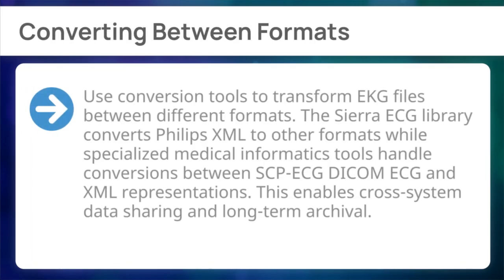Finally, converting between formats. Use conversion tools to transform EKG files between different formats. The Sierra ECG library converts Philips XML to other formats, while specialized medical informatics tools handle conversions between SCP ECG, DICOM ECG, and XML representations. This enables cross-system data sharing and long-term archival.